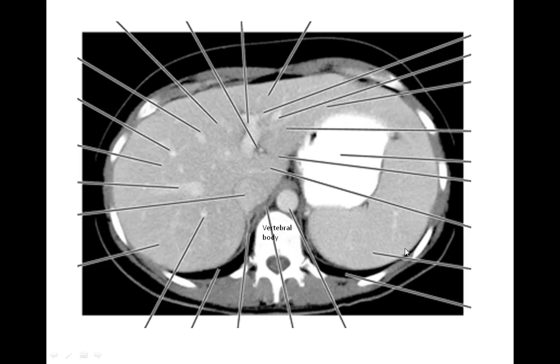We've also got the ribs, which lie further laterally. The next layer up from bones was the muscles of the posterior abdominal wall. We can't see the psoas major or quadratus lumborum muscles quite yet, but what we can see is the crura of the diaphragm, which lie either side of the abdominal aorta. As this line indicates, the crura basically wrap around the aorta, which is here.